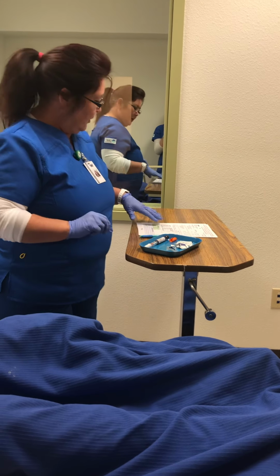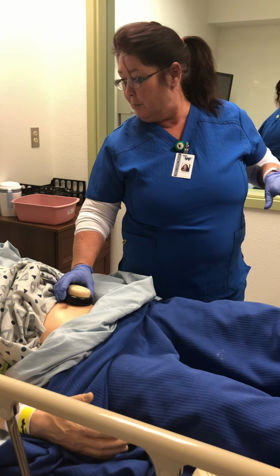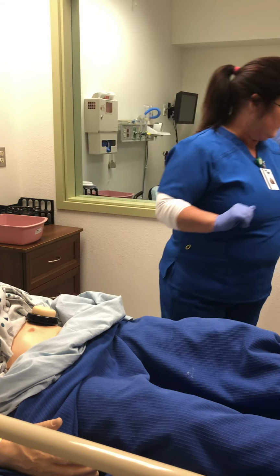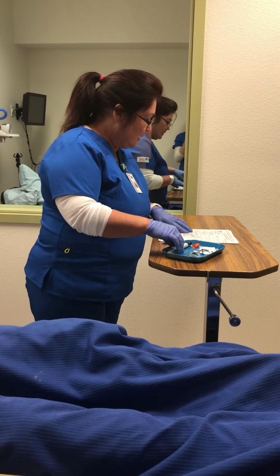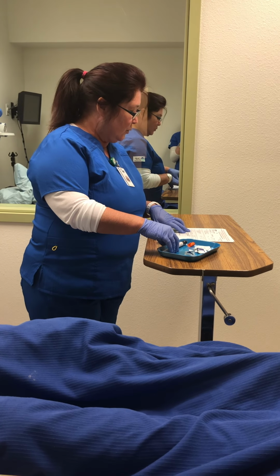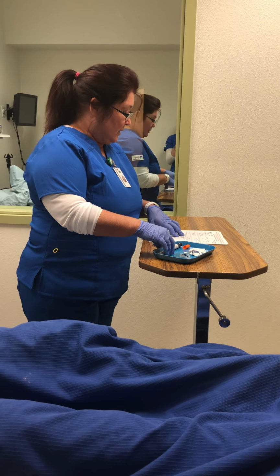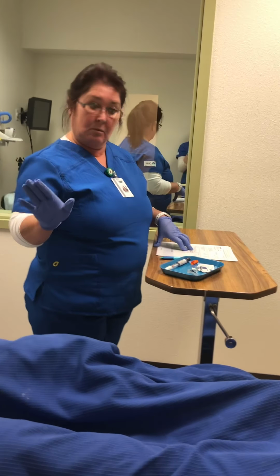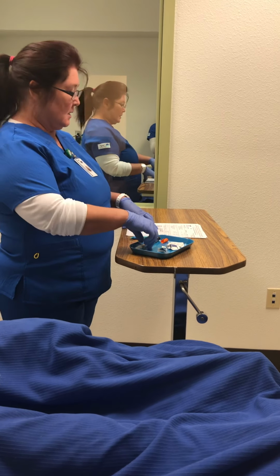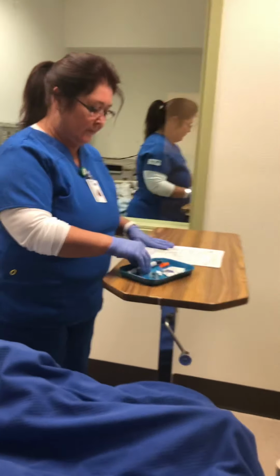And now we are going to move to the other site. Shirley, we're going to give you your insulin pen on the other side of your abdomen, 2 inches away from the umbilicus. So I have my Practi Insulin Lispro U100 insulin pen, mild sliding scale, subcutaneously, 3 times a day with her meal. She has her meal, so we're good. And Shirley, I'm going to give you 2 units because the CNA told me that your blood glucose was 178.